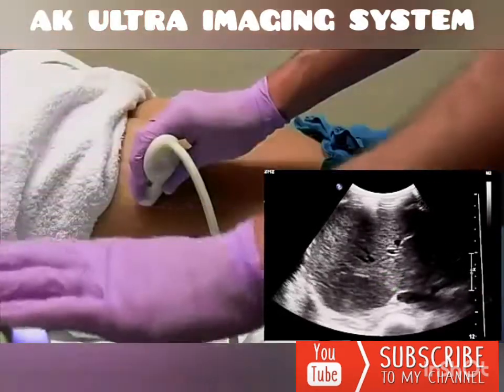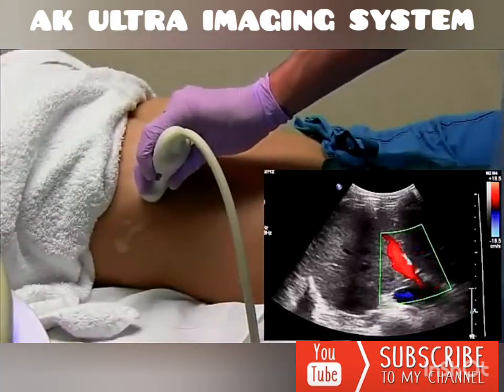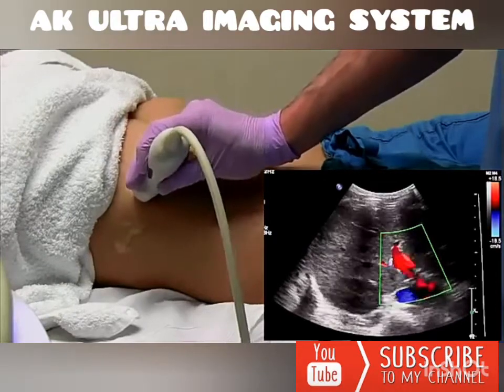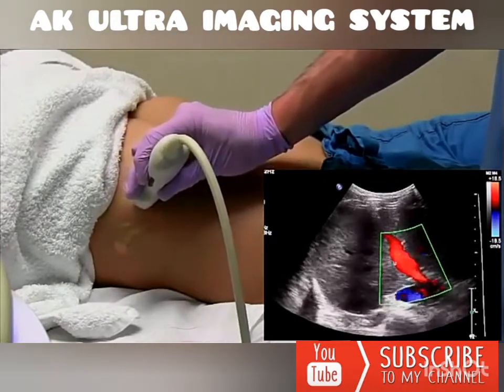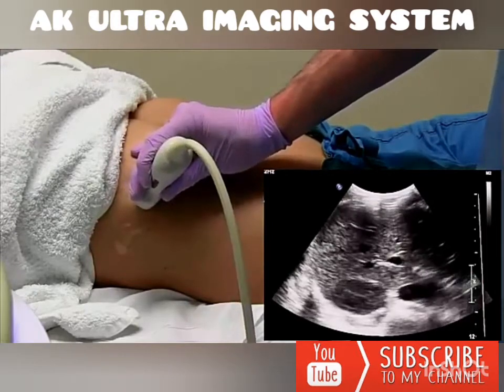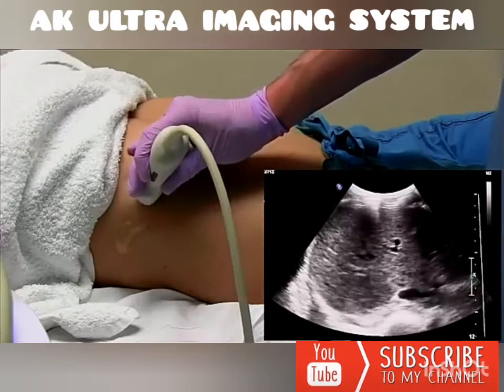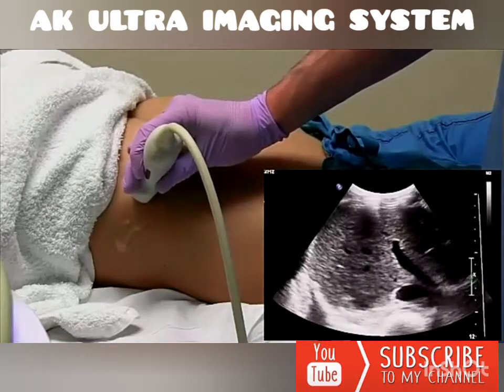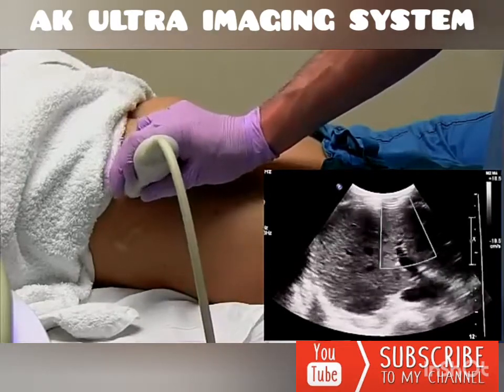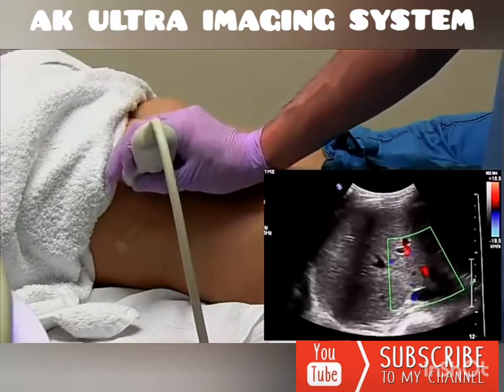So you get good color fill, and you have an accurate pulse Doppler measurement if you need it. So once you find that main portal vein, which you look for the echogenic walls, you elongate it, and from there you know that the hepatic artery and the CBD are going to be right next to it as well.